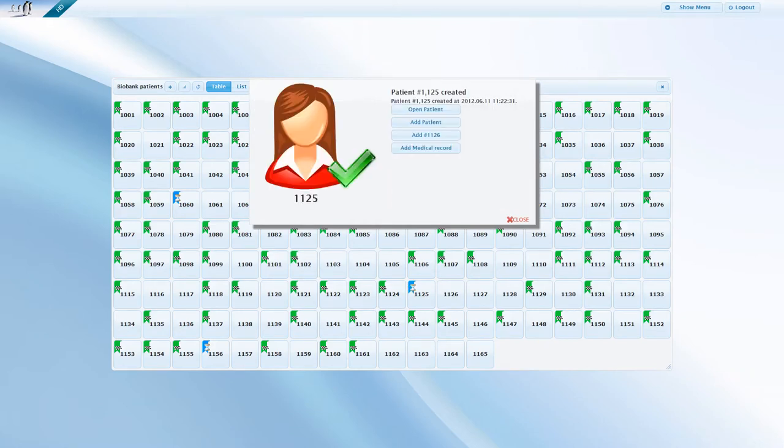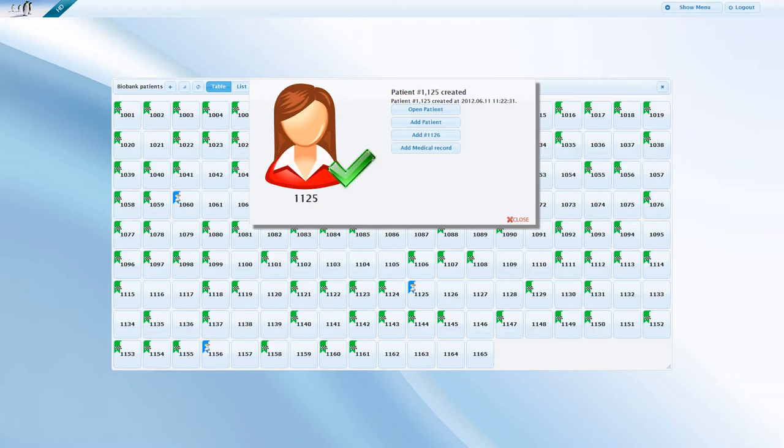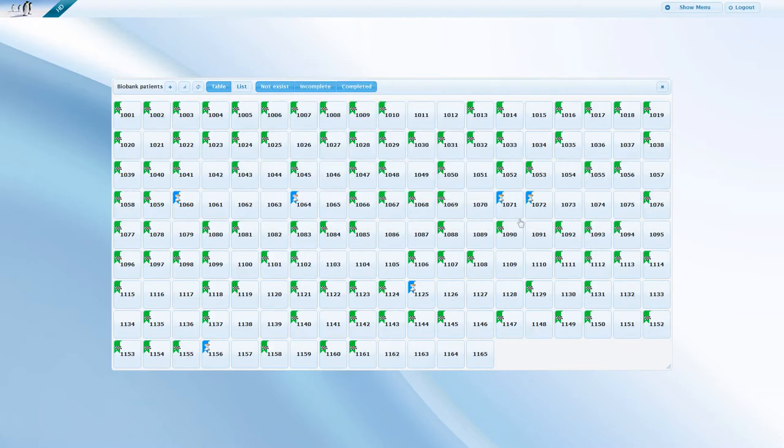From this window, you can open the newly created patient, add a new one, add a patient to the next empty slot, or start entering the medical records of this newly created patient straight away. Alternatively, you can simply close this window and the new patient is moved to the incomplete group.